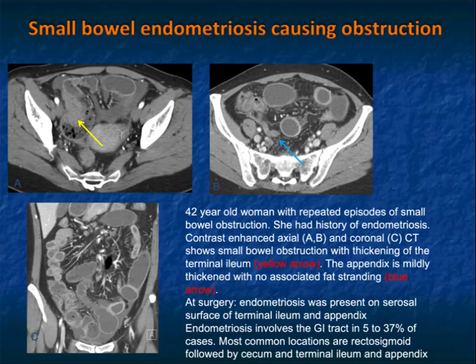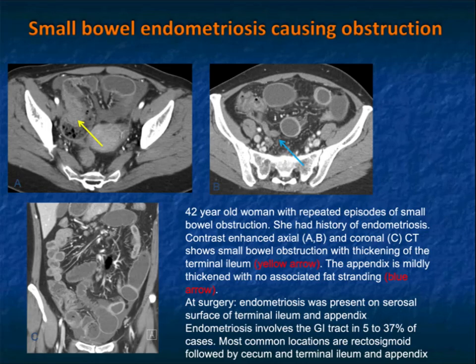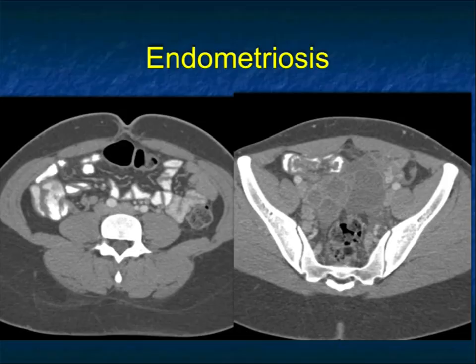Here's another example with small bowel endometriosis with multiple implants on the patient's distal small bowel. There's ascites and proximal bowel dilatation. At surgery, there was endometriosis on the serosal surface of the terminal ileum and appendix. Endometriosis involves the GI tract in 5 to 37 percent of cases, with the most common location being the rectosigmoid, followed by cecum and terminal ileum. It can really simulate processes in the right lower quadrant, including lymphoma and Crohn's disease.